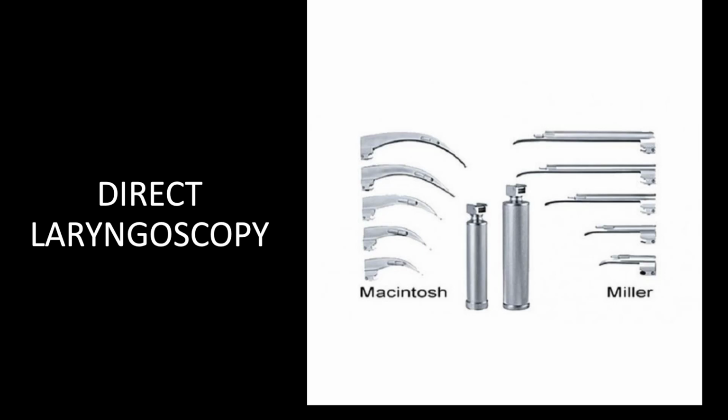The laryngoscopes range in size, but generally an adult patient is going to use a size 3 or 4 blade. People have different preferences in blade size. It's a personal choice, and you need to be comfortable with whatever blade size is your first line option.